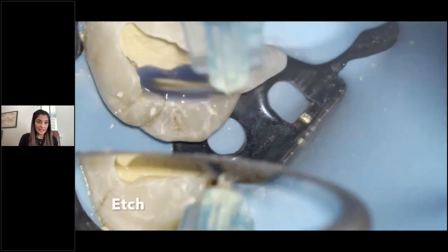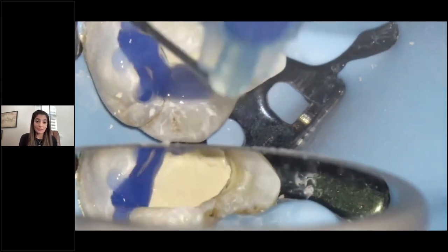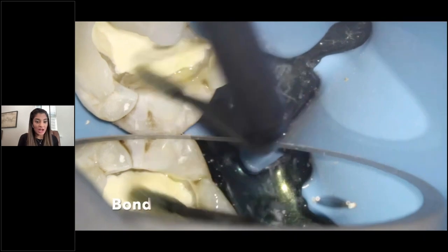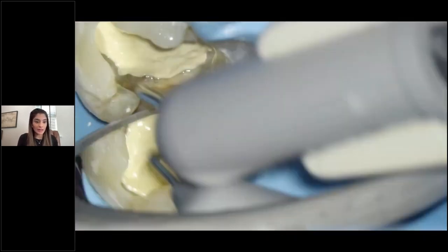And you can see here, I used to etch and bond the dentine and the enamel, but naturally it would fall on my Biodentine. But again, we know now that if we're restoring teeth in a single visit, ideally we don't want to etch the Biodentine. So we'll talk about that and the new protocol in a second.